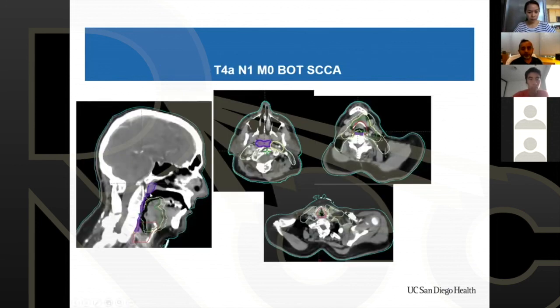Just showing you what this contouring looks like. So here's a patient of mine. Again, that same patient I showed you earlier, base of tongue patient. And you can see that up here, we actually cheat. We kind of draw all the constrictors as one structure and then arbitrarily divide them up by the vertebral body for the dosimetrist as superior, middle, and lower. And so, you can see here drawing that, right? So here's that superior constrictor muscle drawn in.